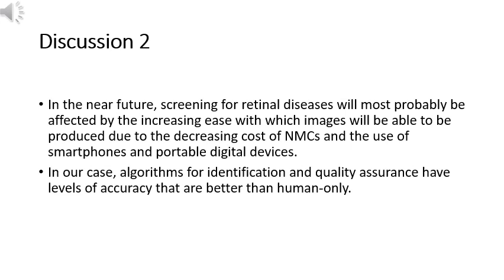To guarantee the quality of the images, some authors perform a manual evaluation of their databases 16,29. While this system is suitable for retrospective studies, using it in prospective studies is not ideal. Other authors point out the need for training and certifying photographers 19, which certainly substantially improves the image quality.